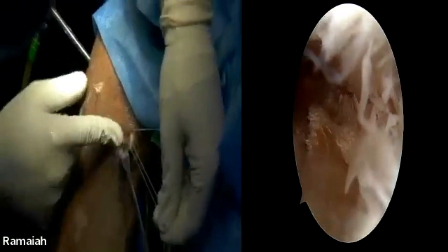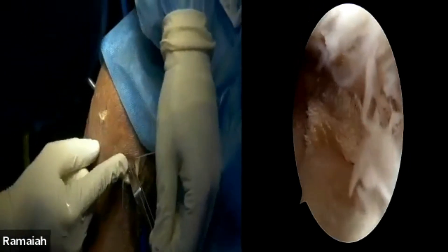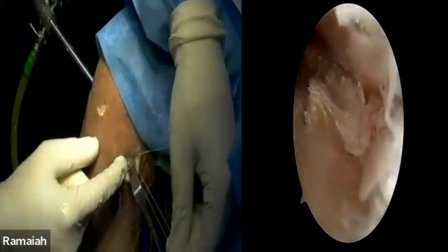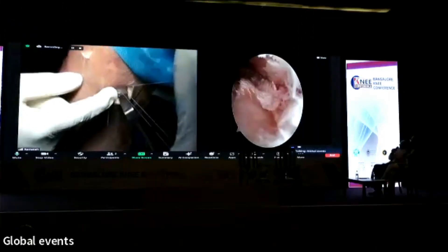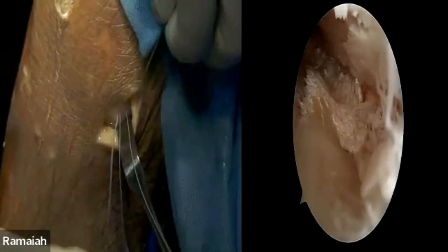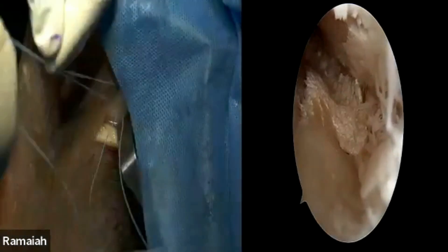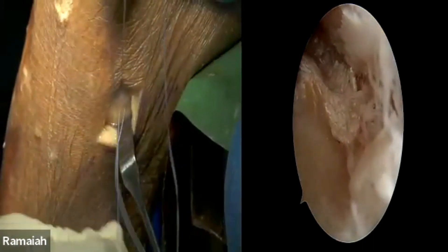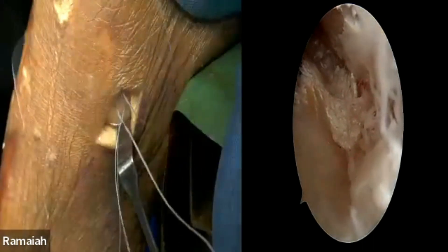There is no soft tissue in between — only the posteromedial capsule is there. So this is one of them, and this is another one which I already did before. We are putting the knot here. I am pretty sure there is no soft tissue trapped. This is one way of doing it.